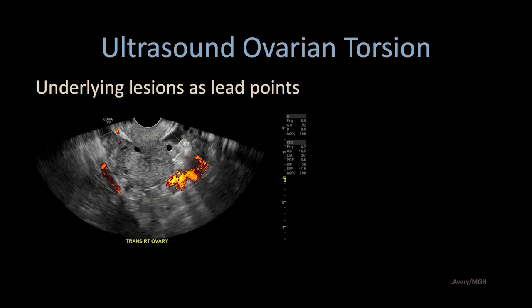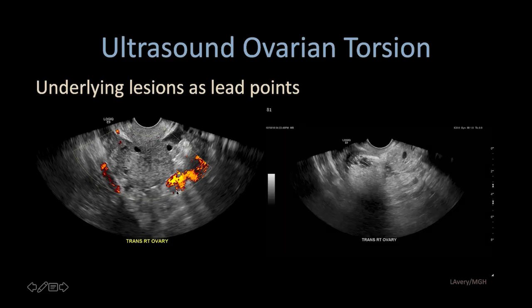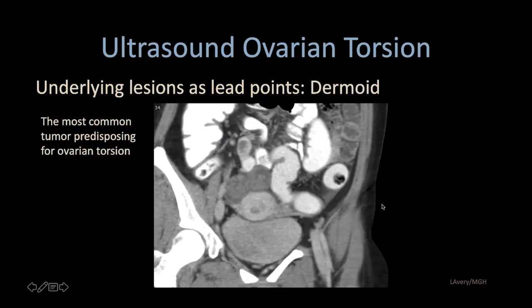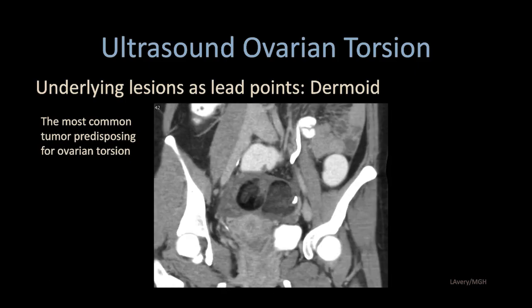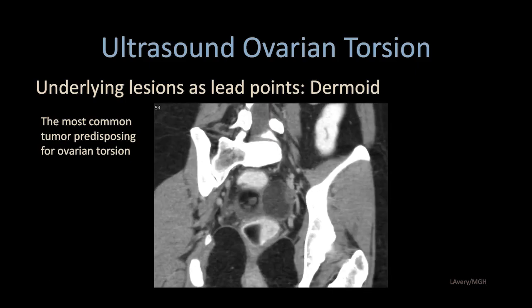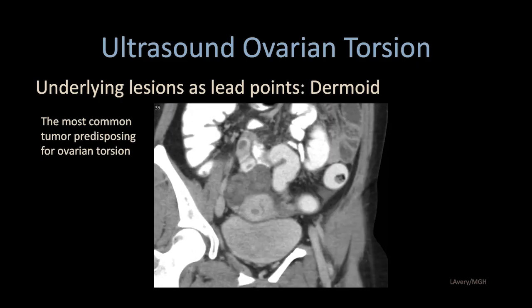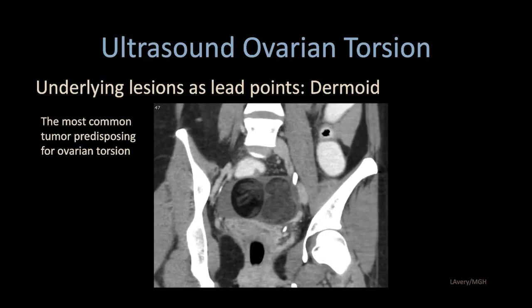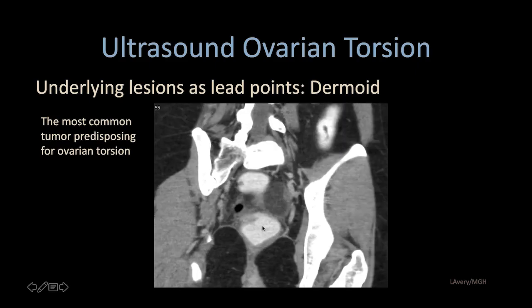Ovarian torsion often happens in the setting of an underlying lesion — a lead point. Here we have an ovary with enlarged follicles, heterogeneous echo texture, and no flow on power Doppler. More laterally within the adnexa, we see the heterogeneous tip-of-the-iceberg appearance of a dermoid cyst. Underlying lesions such as a dermoid are frequent in ovarian torsion. This is a very large dermoid with heterogeneous fat, calcifications, and soft tissue elements, positioned up and over the uterine fundus in a torsion configuration.